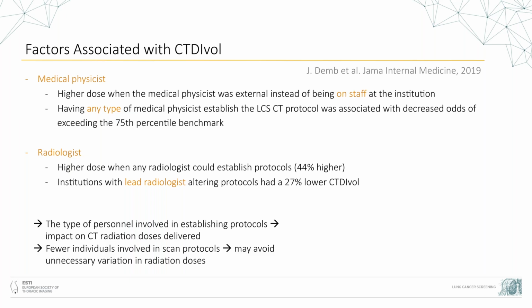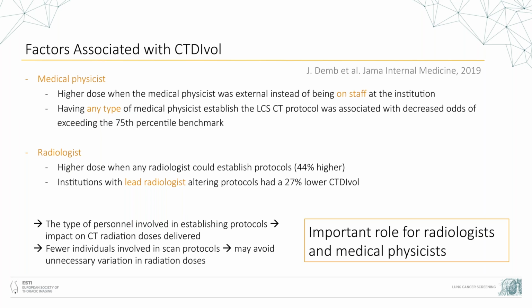So the type of personnel involved in establishing protocols has an impact on CT radiation doses delivered, and fewer individuals involved in scan protocols may avoid unnecessary variation in radiation doses. So I think what this study emphasizes is that there is an important role for radiologists and medical physicists in radiation dose in low-dose CT lung cancer screening.